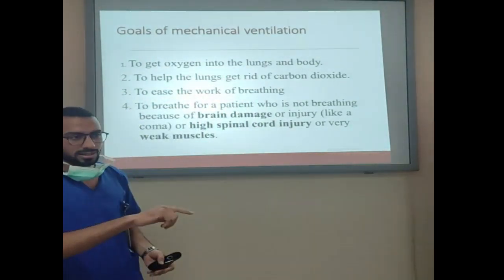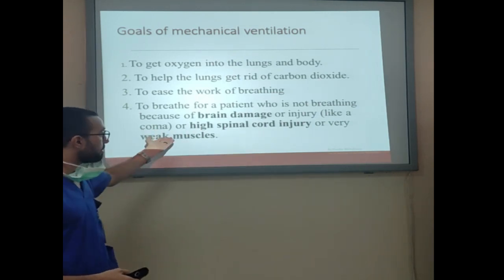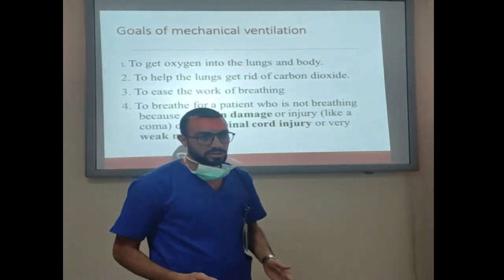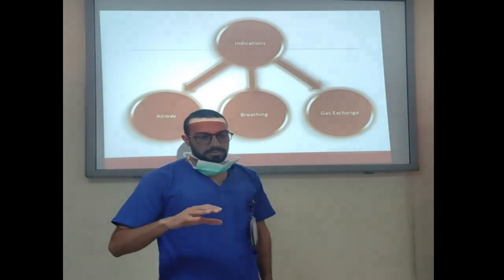So the problem is not the lung itself. The ventilator breathes for a patient who is not breathing because of brain damage, injury like coma, or high spinal cord injury. So these patients also, the ventilator can support them. Anyway, now to talk about the indications.